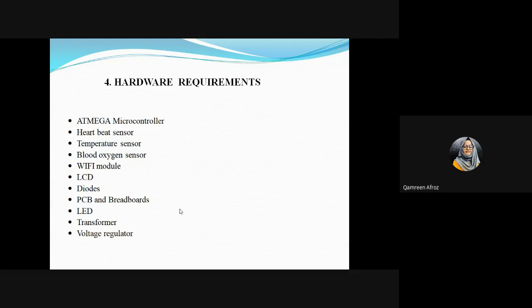The microcontroller gives the commands to the LCD, that is 8-bit for communicating. And then register select, like command register and data register pins, are used here, like read, write, data register, and then the enable signal.